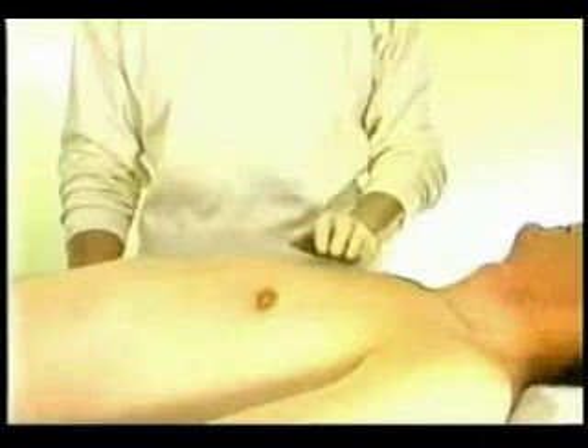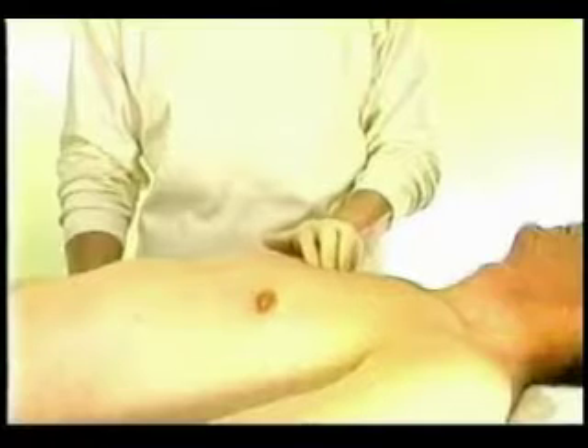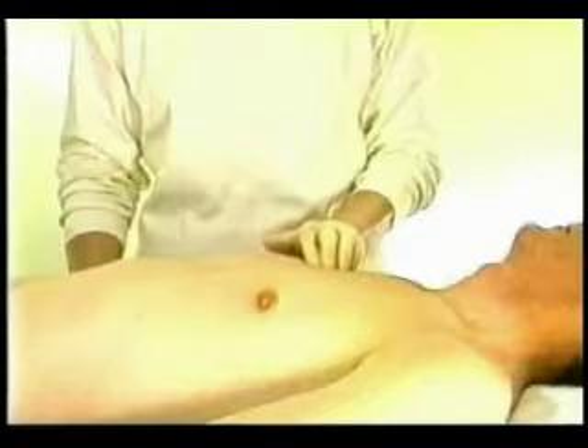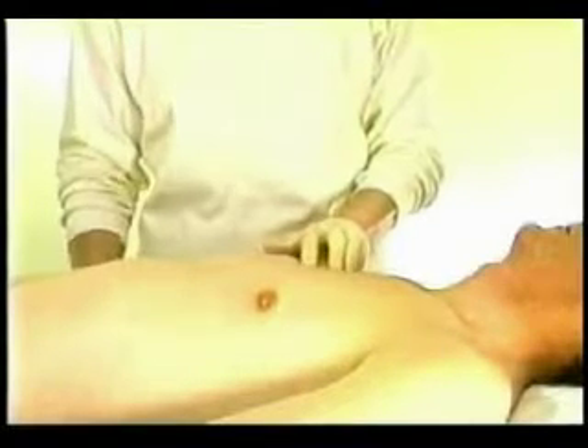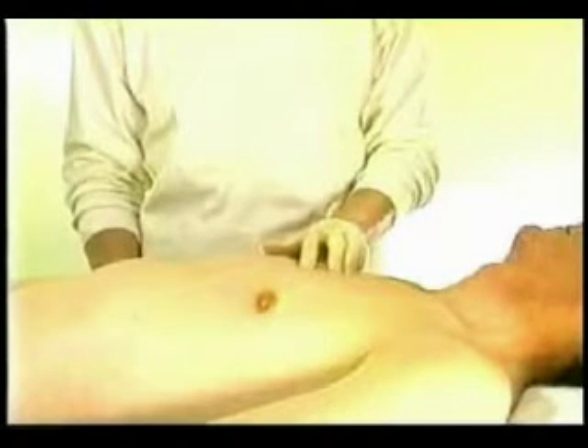I start with careful palpation and estimation of the size of the mass and the depth under the skin. I then place my fingers on top of the mass, spread them, and hold the mass firmly.